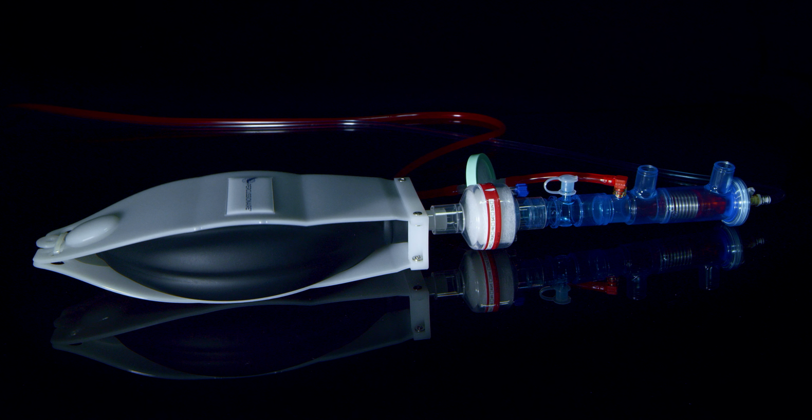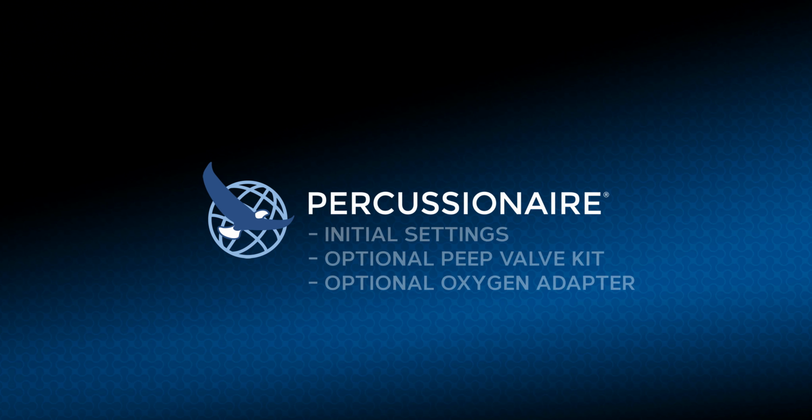If there is a large chest wiggle, decrease the amplitude by 2 to 4 centimeters to achieve a gentle wiggle. If there is no visible chest wiggle, increase the amplitude by 2 to 4 centimeters until a gentle chest wiggle is achieved. Initial settings and adjustment with optional PEEP valve kit and oxygen adapter.